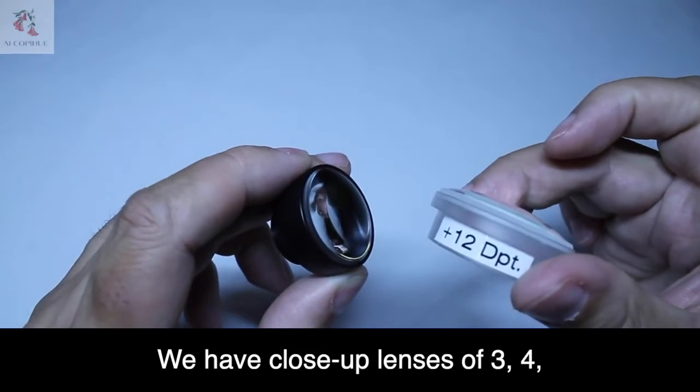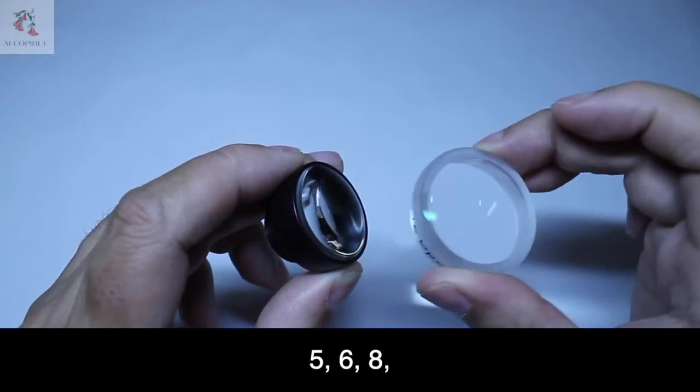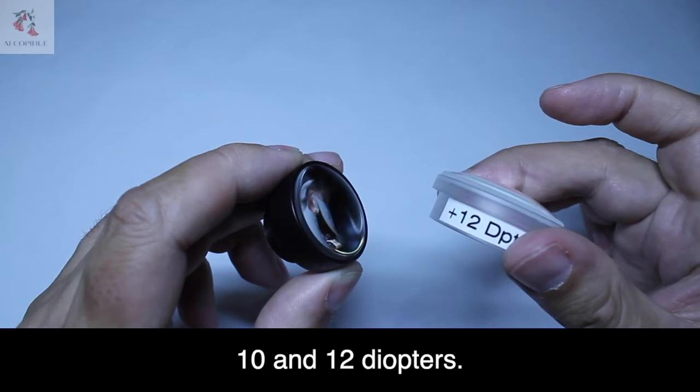We have close-up lenses of 3, 4, 5, 6, 8, 10, and 12 diopters.